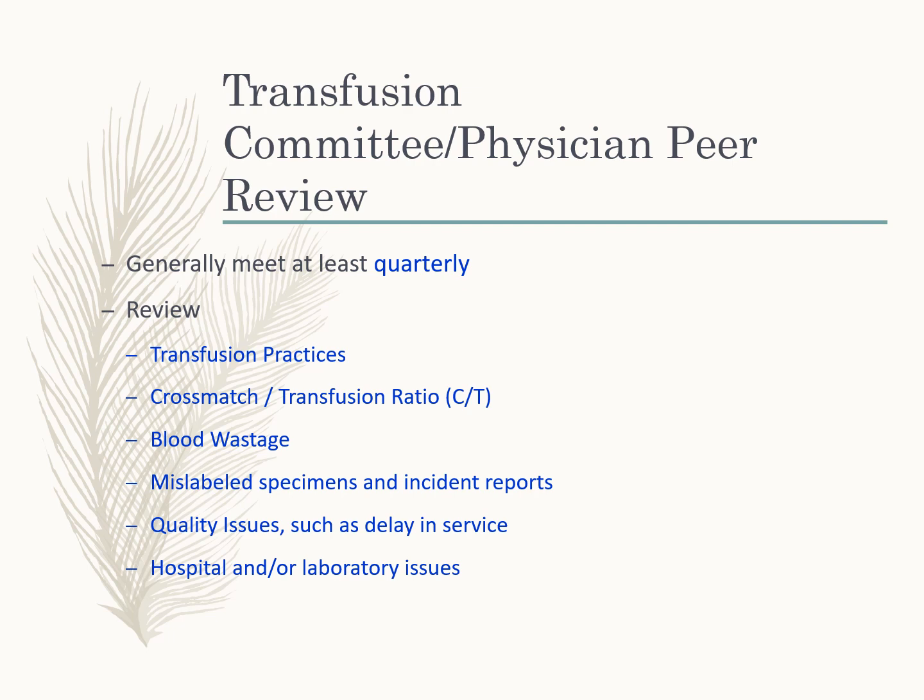How many mislabeled specimens were there? How many incident reports were there? Any quality issues that may have delayed service, that patient getting a transfusion, or any kind of delay in service. And then any kind of hospital or laboratory issues. Basically, you just want to make sure everything is moving smoothly and you're wasting as little as possible.